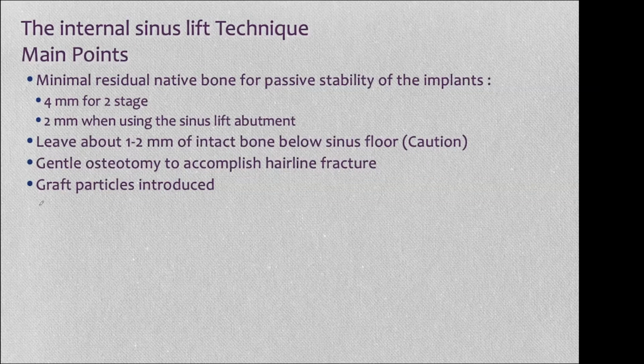That tapping compacts them and makes them behave as though they are part of the instrument, lifting the mucosa off of the floor. However, because of the shape that they are in, because they are spreading in all three dimensions, you will not force the mucosa only vertically, but rather you will push it on all sides, causing the mucosa to separate from the floor of the sinus. And then when you are not tapping, that simple weight of the mucosa, just the elasticity of it, will make the graft kind of relax and go back to the sort of liquid phase, and they stay where they are.